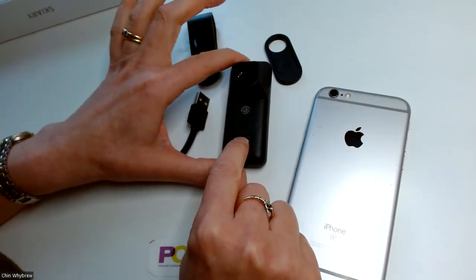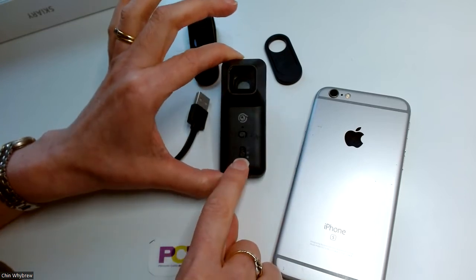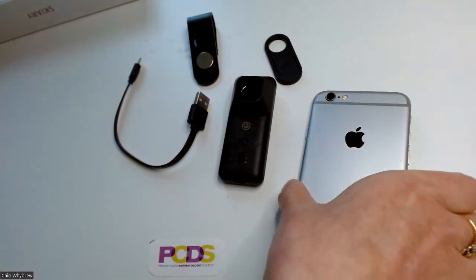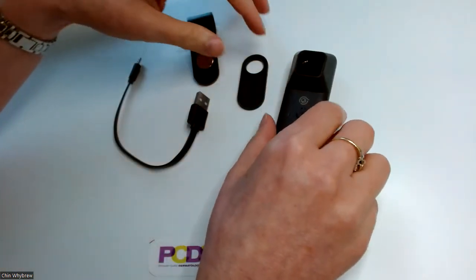The third position, this one here, which is the ultraviolet light, doesn't have a huge number of uses in my experience. It will fluoresce with some fungal infections. It will fluoresce around the edges of scabies burrows, and it may be helpful to show where the edges of melanocytic lesions on acral surfaces are. But that's basically all you use it for. We don't use that one terribly often.